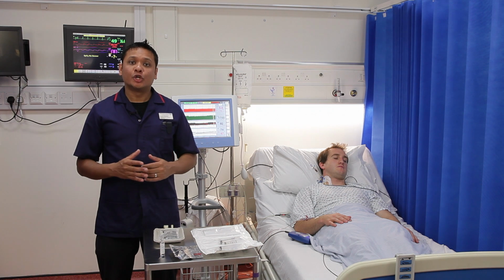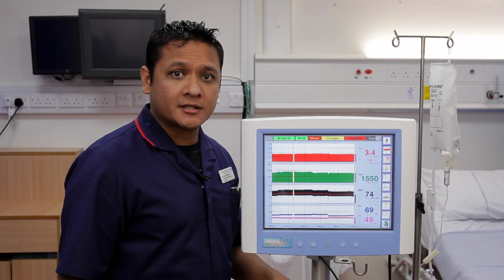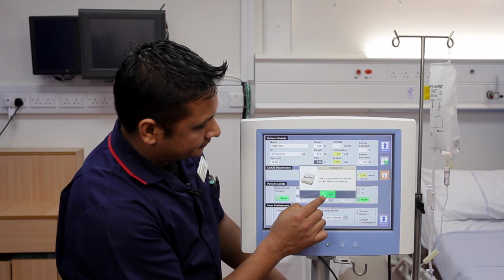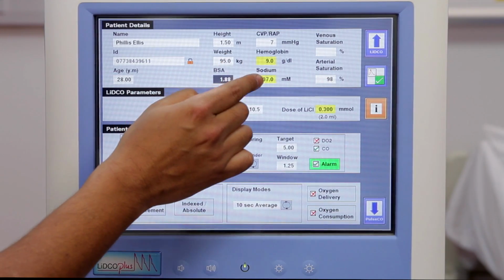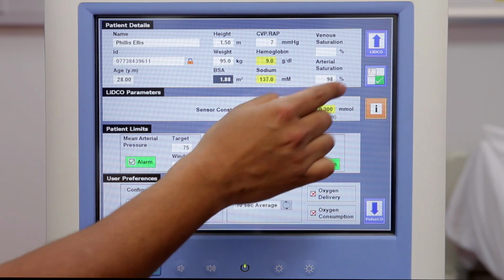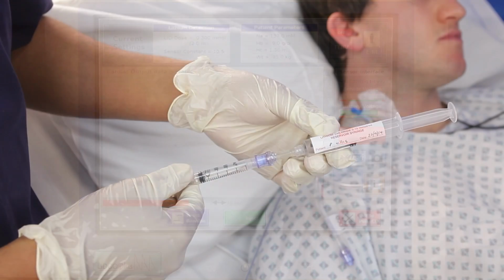In this section, you will learn how to calibrate the LiDCO Plus. Before we start the process, touch the LiDCO button twice and press OK. Make sure you have updated the hemoglobin, the sodium and the dose of lithium values. Once you have done this, press the LiDCO button in the top right hand corner to enter the calibration screen.